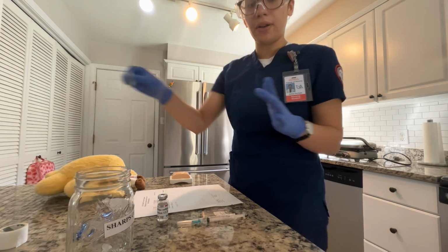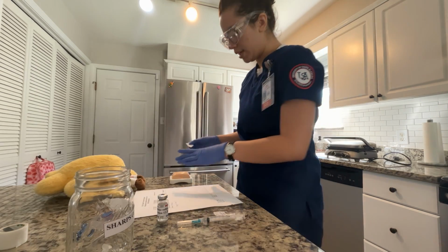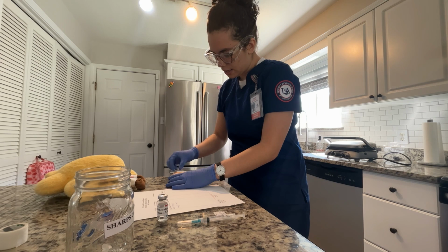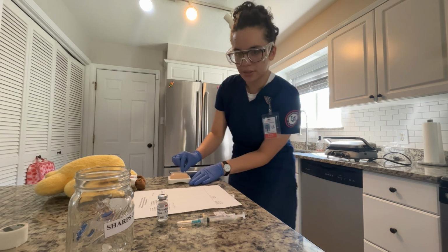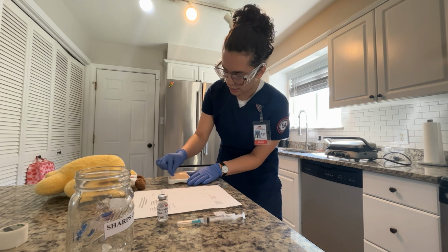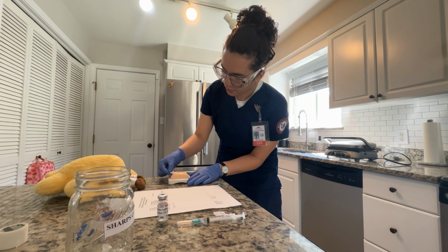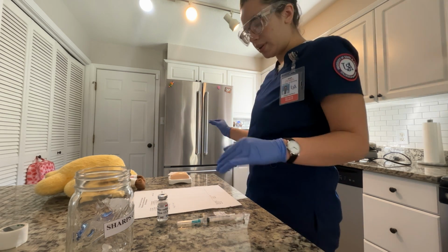Rather, I would get an alcohol swab, and I would clean the area in a circular motion. I'm making sure you can see that. There you go. And then I would take the alcohol wipe and place it right there, just so that I know where I want to go.